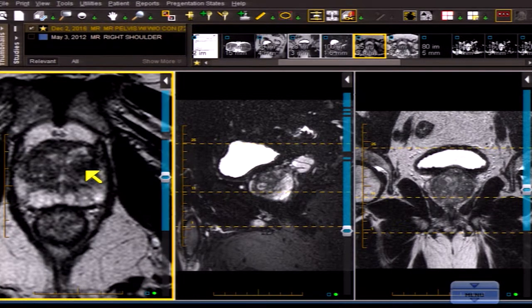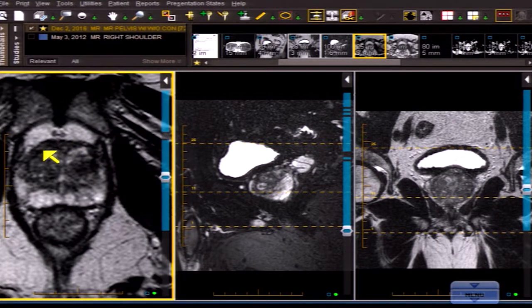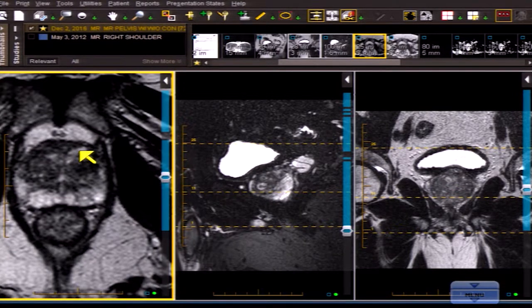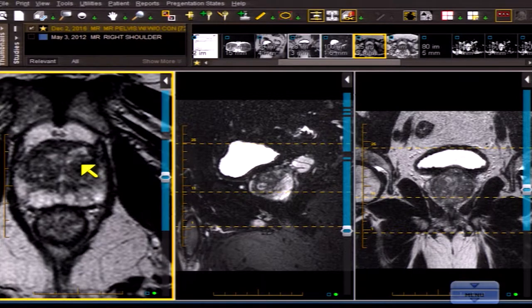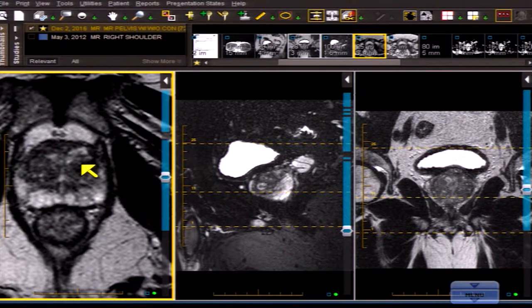Regional means the abnormality conforms to a prostate sector, sextant, zone, or lobe — an abnormal signal other than a mass involving a large volume of prostate tissue. For instance, if involvement extends down to the apex and invades the fibromuscular stroma, we'd say 'regional, apical, with fibromuscular stroma invasion.' Or if it's completely right-sided in the mid gland, we'd call that regional, confirming medial and lateral involvement.